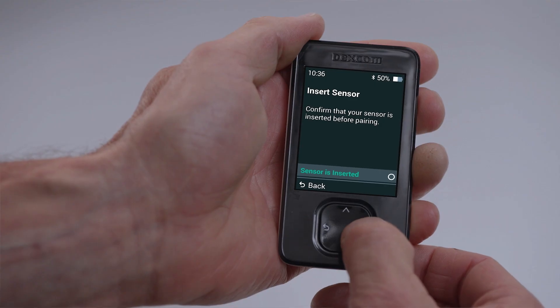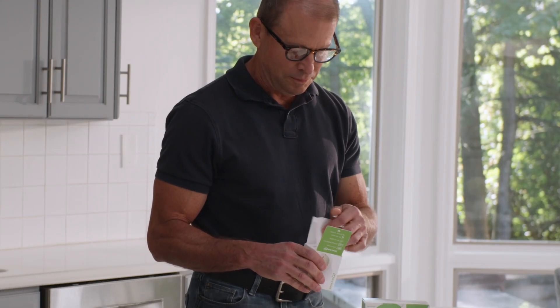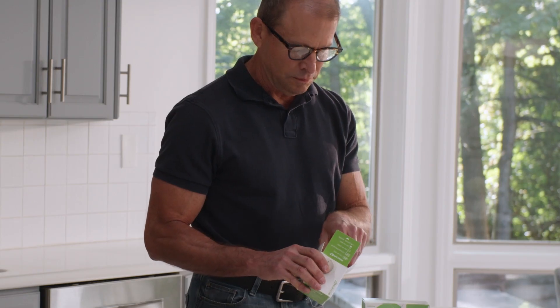After the tutorial, you will be prompted to insert your sensor. For printed instructions and sensor site locations, see the instructions in your sensor box.